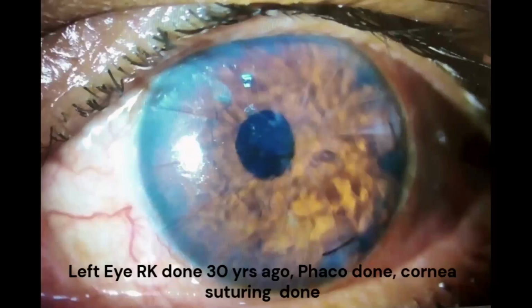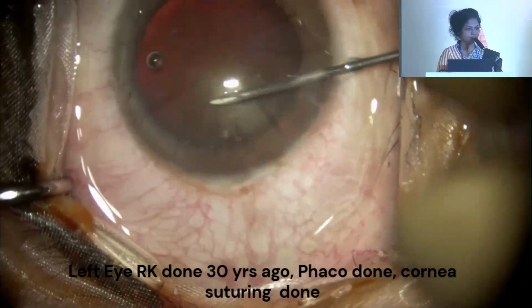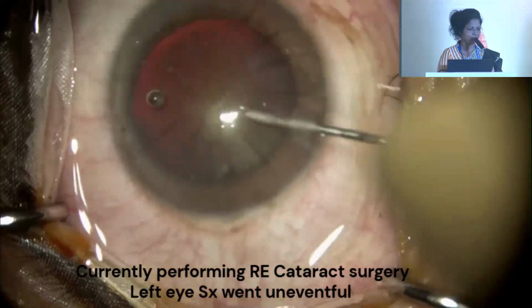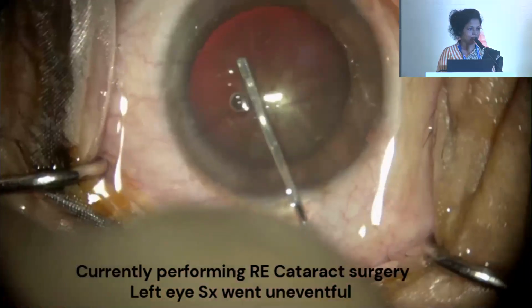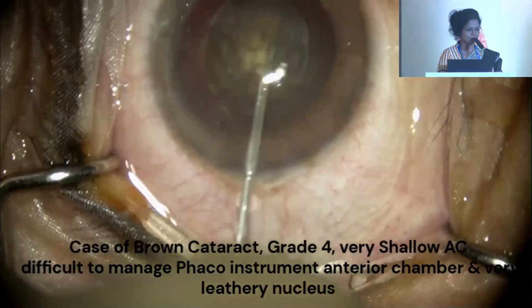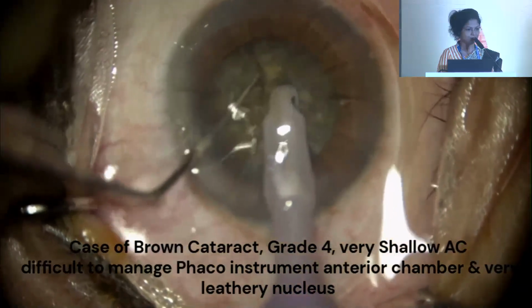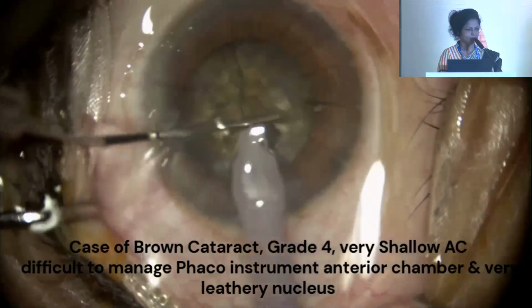So this is a left eye, previous RK done, and the phaco surgery done and suturing of the cornea done. So now we are doing the right eye surgery. Though the left eye went uneventful, in the right eye, at the end we will show what the limitation was. To describe, this is a case of brown cataract, grade 4, and very shallow AC. So it is very difficult to manage the phaco instrument within the anterior chamber.